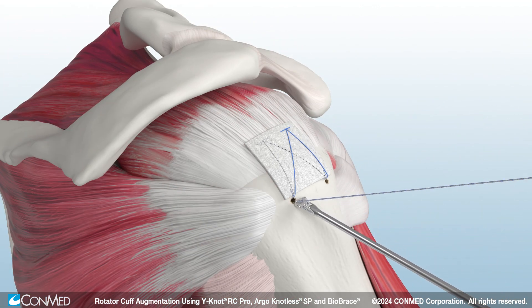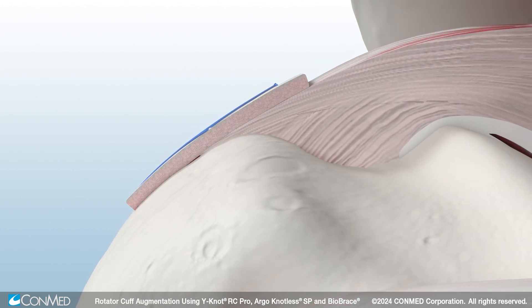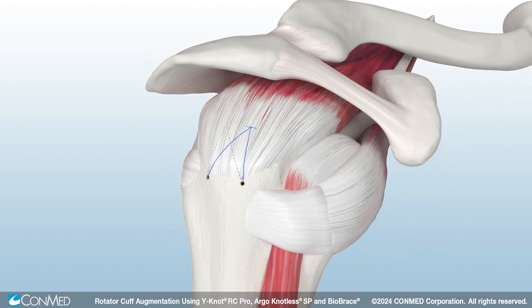Finally, use the Katana flush cutter to complete the augmentation. Biobrace defends your repair by load sharing for up to two years, while it induces rapid cellular infiltration to generate new tissue in and around the scaffold. The result is a surgical repair that is as strong as native tendon by 12 weeks.